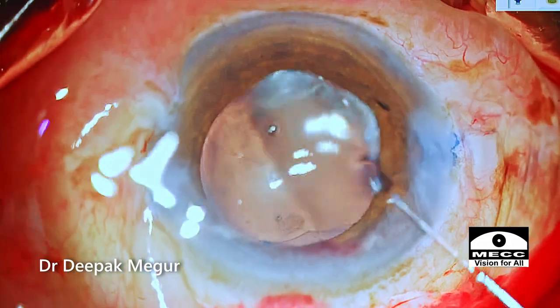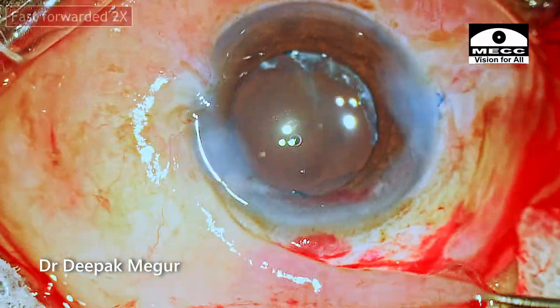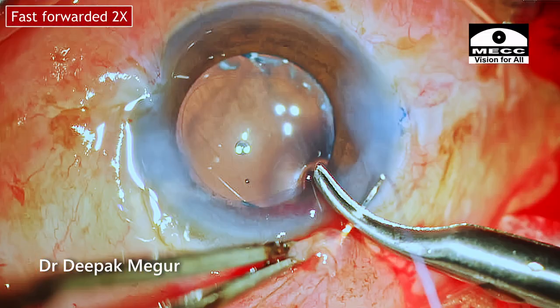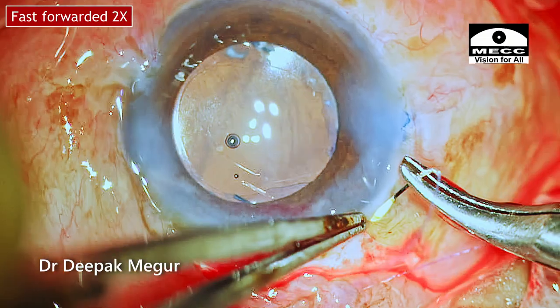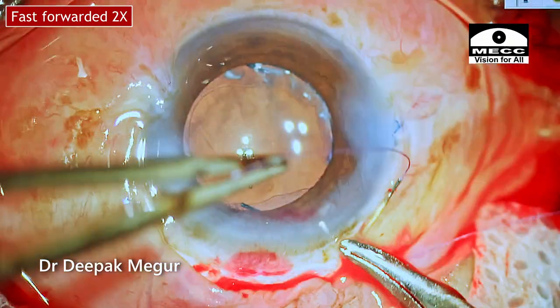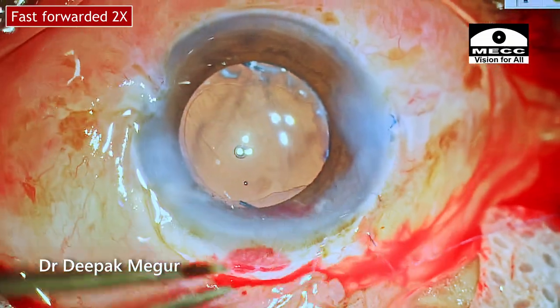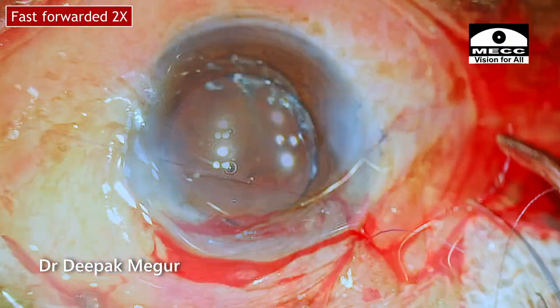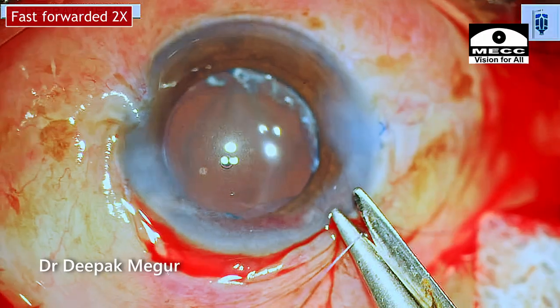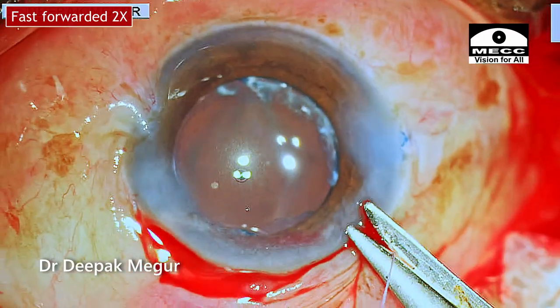Time to close. The conjunctiva is covered back and I'm using a buried knot of 8-0 Vicryl to cover the scleral incision. And that's it — the case was done.